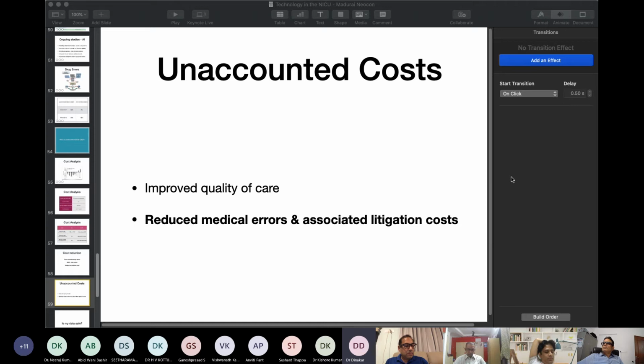During the inflation itself, it will give the reading. Oscillatory is not during inflation; when the air is going out, that time the BP is obtained, that is oscillatory. Suntech is using another method. It is more accurate for a neonate. So if anybody is buying a new monitor, please ask whether you are having Suntech NIBP. It is more accurate. Regarding the TCO2, I think she is going to tell us, and Ram and Suresh might have done a great job.